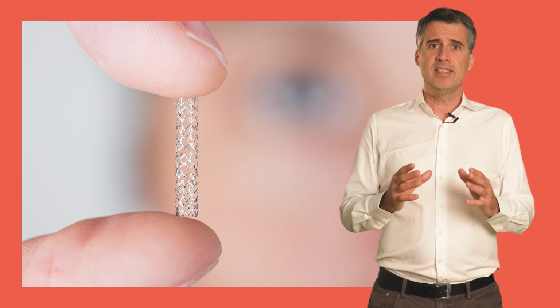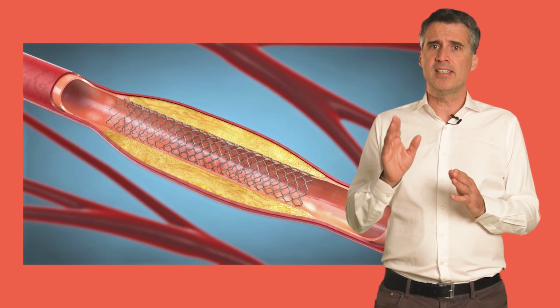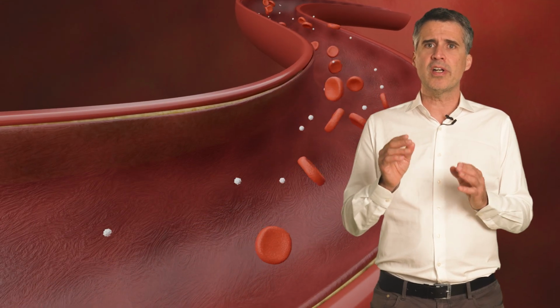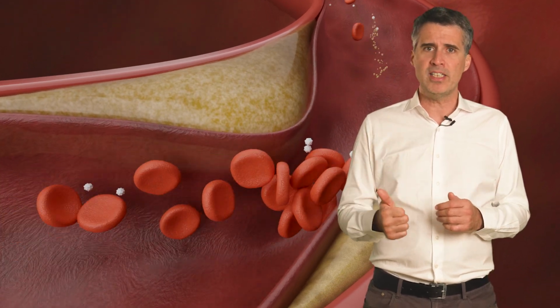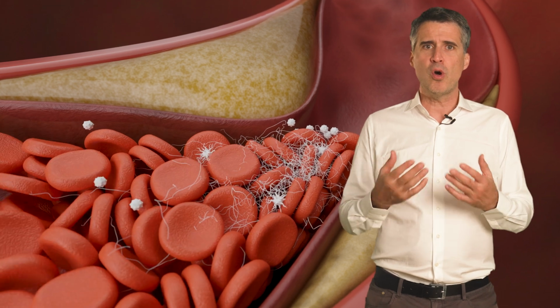The stent is this device that we see here, and this is how it is positioned inside the artery. In this image, we see this arterial narrowing called atherosclerosis. This artery disease is related to hypertension, poorly controlled diabetes, cholesterol, smoking, and sedentary lifestyle. These factors gradually harm the arterial walls, causing them to harden and narrow over time.